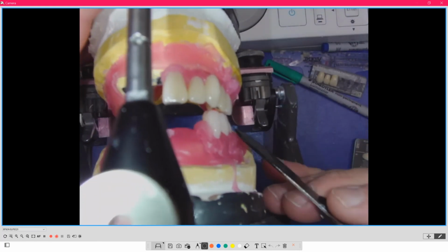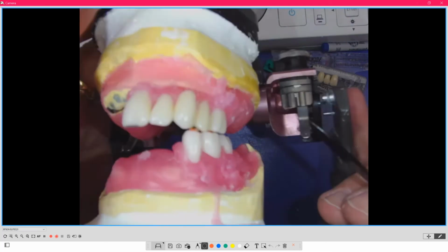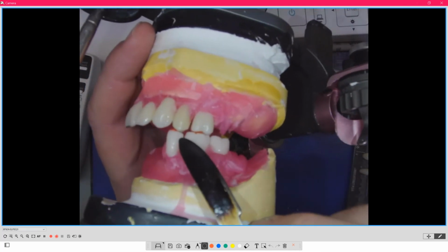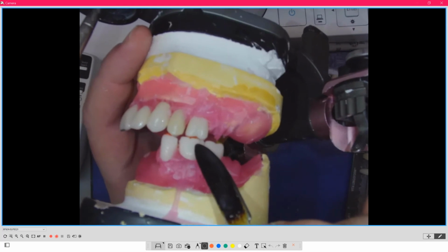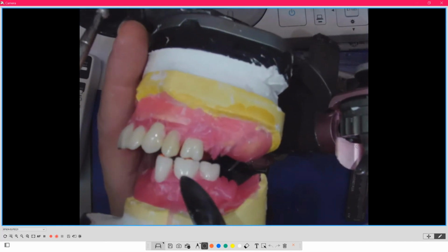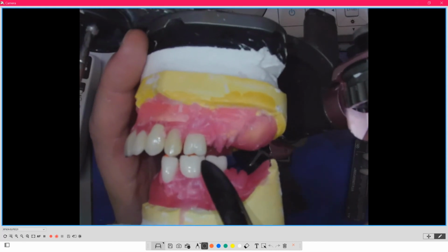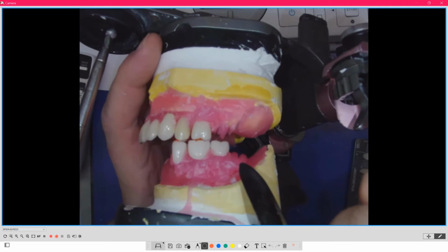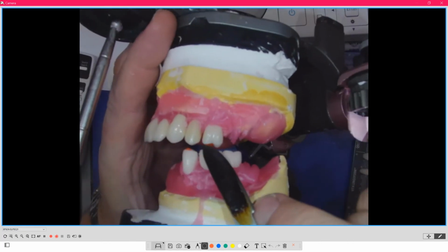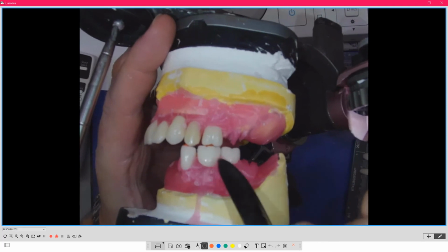There you go. You still have some overlap here, so it's not knuckle tight. And when you look, it's not knuckle tight, because remember, I need somewhere for the food to stay. Yet, it's a lingualized occlusion, but it doesn't necessarily look like a lingualized occlusion. So it doesn't look like one, but it's going to act like one because that cusp in red is going to be smashing the food that's being held in this bowl.